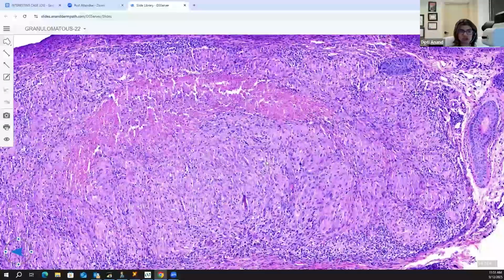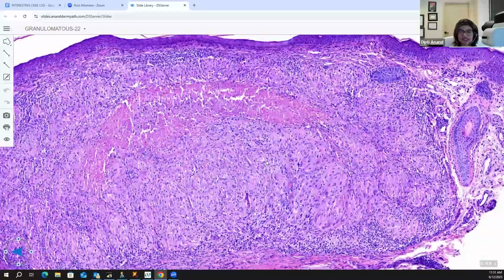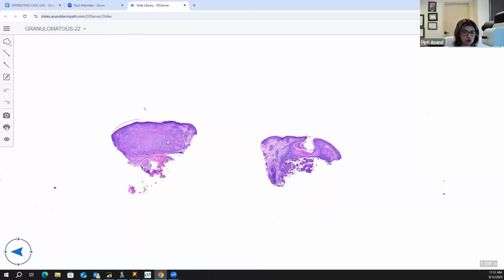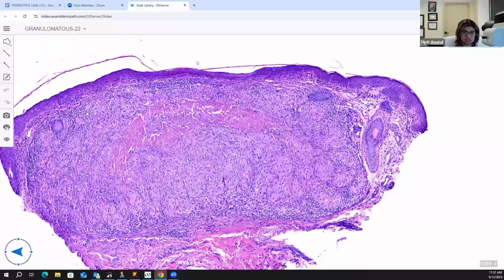You see one large granuloma with central necrosis, which is folliculocentric. And in this case, it is nicely folliculocentric, but this may not always be the case. You may not always see the follicle, so you may just see this half of the biopsy, but you can see it's one large granuloma with the central necrosis. So you presume it to be around the hair follicle. Okay, good.